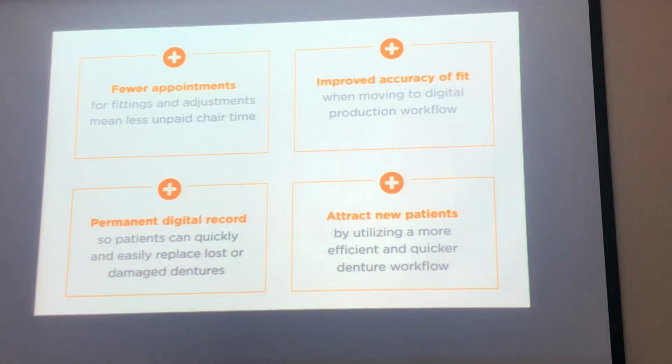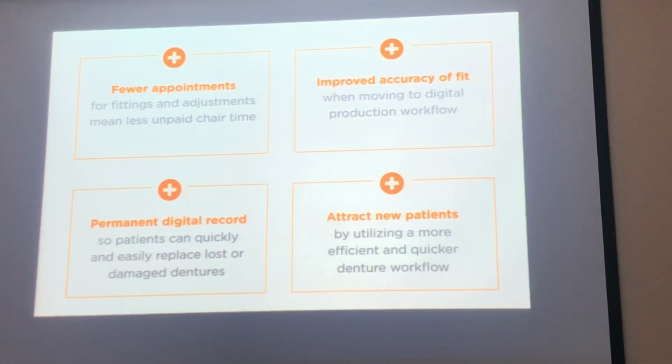We can design, if you want to use digital dentistry in complete dentures, we just take the final impression and then pour the cast. Or if you don't pour the cast, you can send the impression to the lab to do the laboratory scanning for you. Or you send the master cast and the lab will scan the master cast for you.